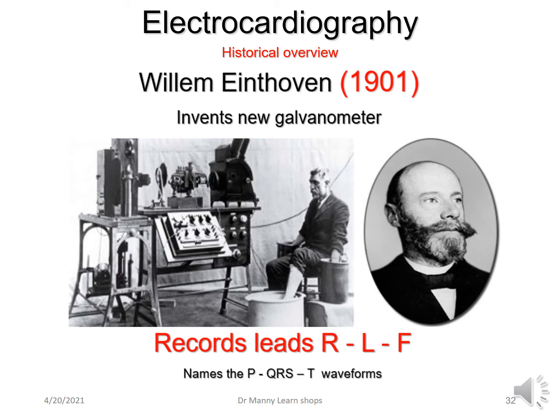And he also labelled them, not in 1901, but later, to PQRST. And they don't actually mean anything, they just represent things. He actually wanted to call it ABCD, and then ABCDE, but he wasn't allowed to, because the scientific community had already used those alphabetical letters for other areas in science. He was left with P, Q, R, S, T, U, V, W, X, Y, Z. So he chose PQRST to label his waveforms. There wasn't any specific reason why he chose those. That was just what was allowed him to have.